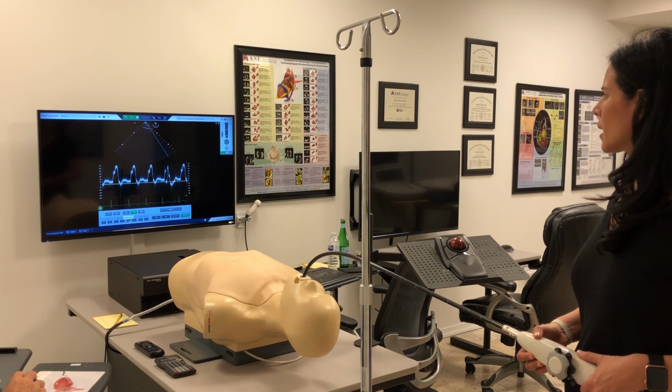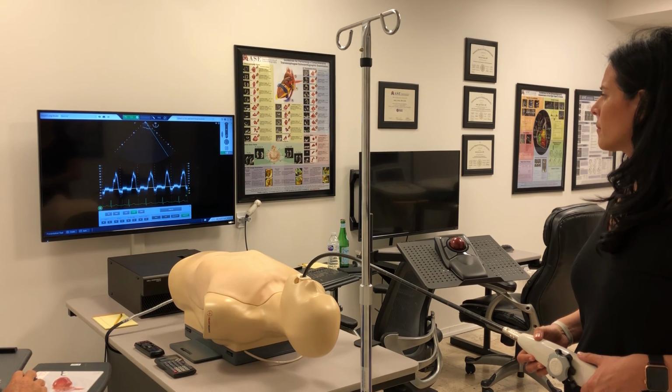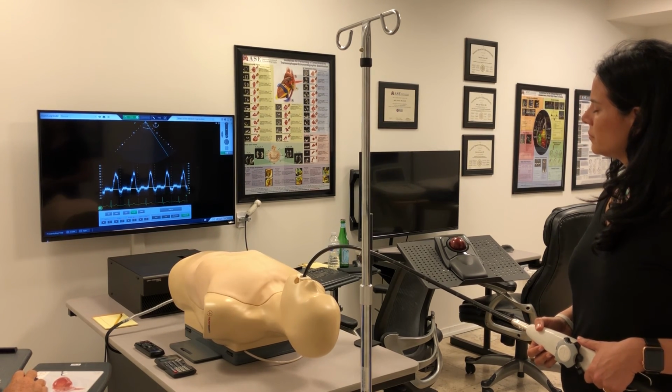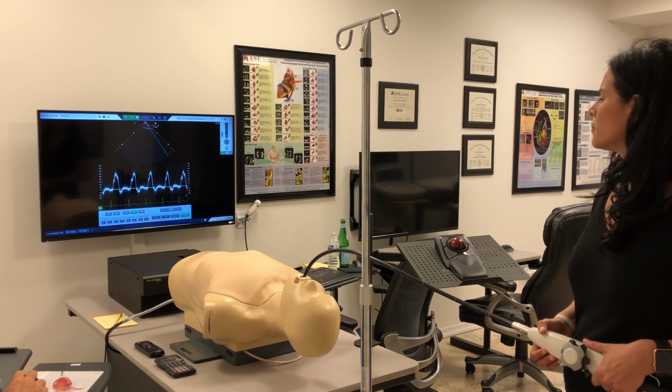Let me just drop the baseline a centimeter or two. Good. Please note that right here is diastolic flow reversal. This is funny because this is flow actually turning around and going back towards the head, and that comes from the elastance of the aorta. During systole, the aorta builds up some capacitance through its own elastance, and when the aortic valve closes, that elastance collapses the aorta, drives a lot of blood peripherally towards the feet, but it drives a lot of blood also proximally towards the neck and perfuses the great vessels. It's called the Windkessel effect.